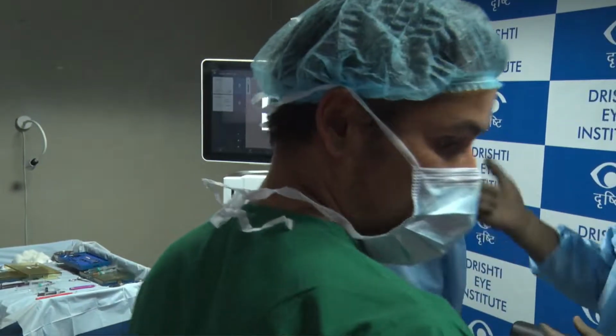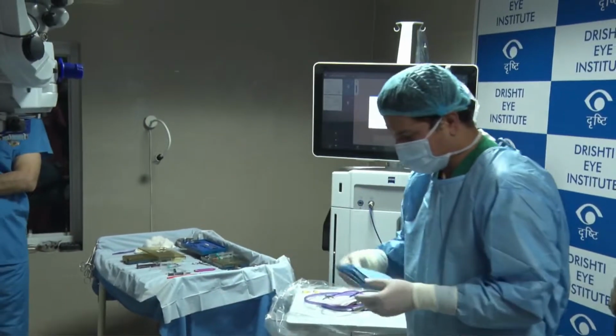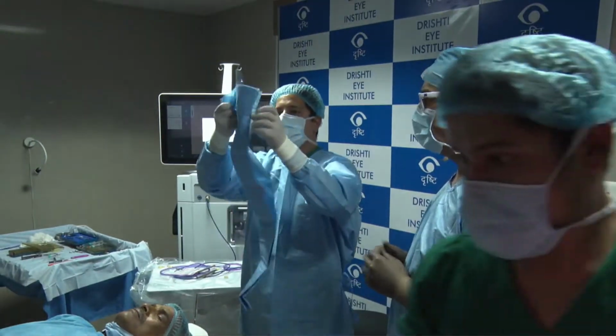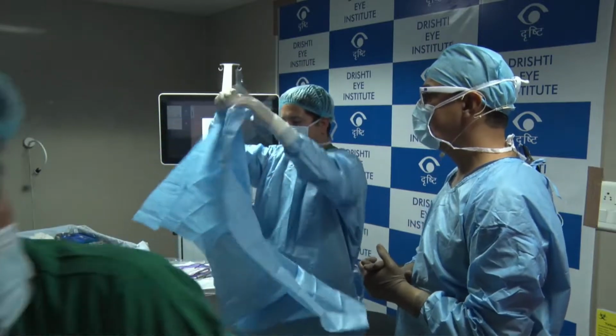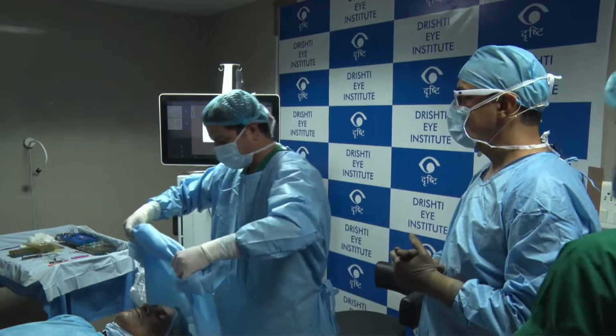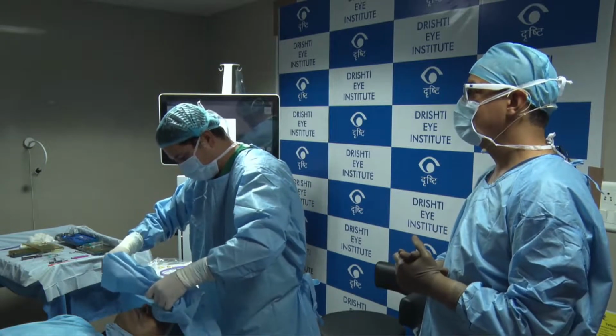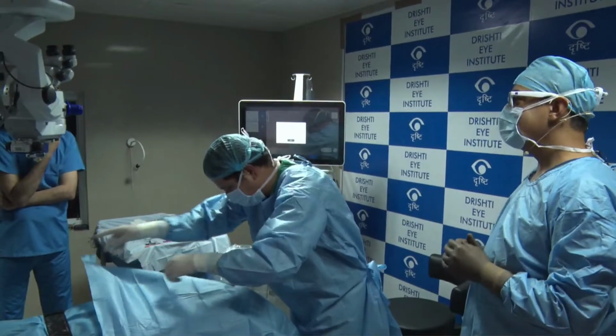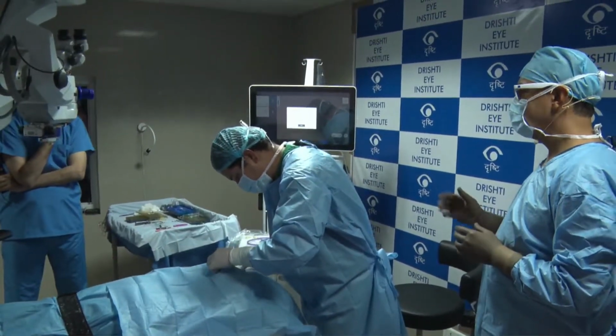Dr. Pandav, how did you like the 3D thing? You were also using the Alcon one there. We have the other one. You have the Alcon one. Is there any difference between the two? I think it's almost the very same, very similar. We have it mostly for the posterior segment, and this is for both. What I realized is that we used that for a month or so here, about 2-3 years back.